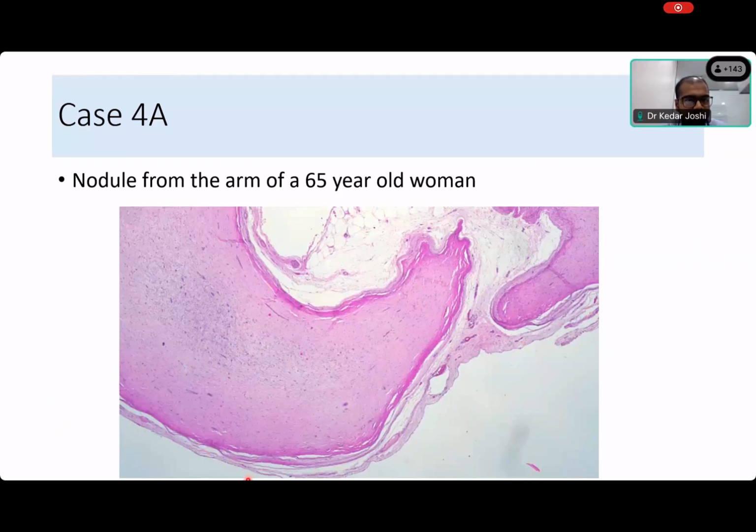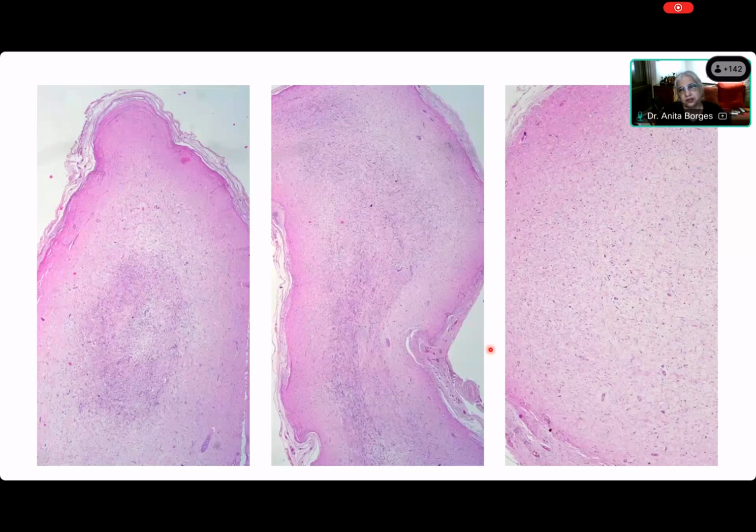It could be a nerve sheath, ma'am. What are you saying about this tumor? Do you think that this is in continuity with that? Obviously, the tissue is in continuity, right? What do you mean by well encapsulated? I see that all of here. How do you describe this? Well encapsulated? Okay, maybe.